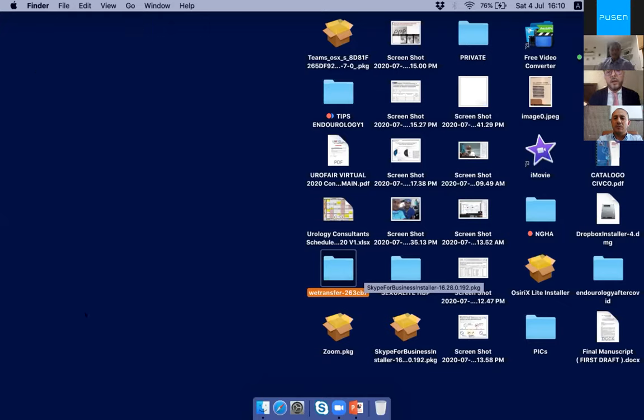Okay, good. And here is another poll, Professor Chi. People have a big debate about using the access sheath. Professor Mehdi presented that the access sheath will reduce the pressure, will save time, and these advantages. How frequently is the access sheath used in China? I use the access sheath routinely for flexible ureteroscopy procedures because, just as Dr. Mehdi said, it's very useful during this procedure.